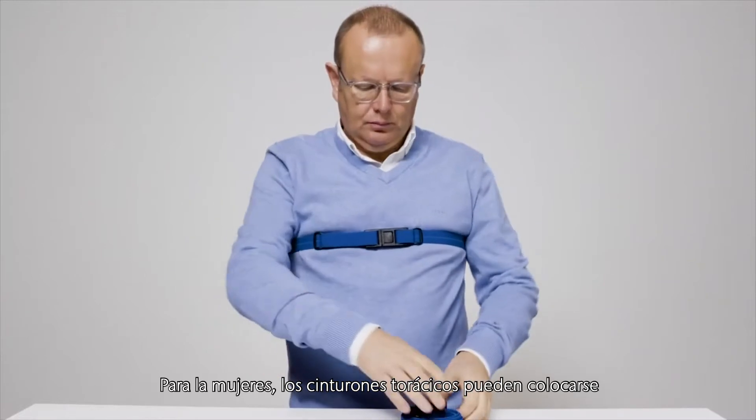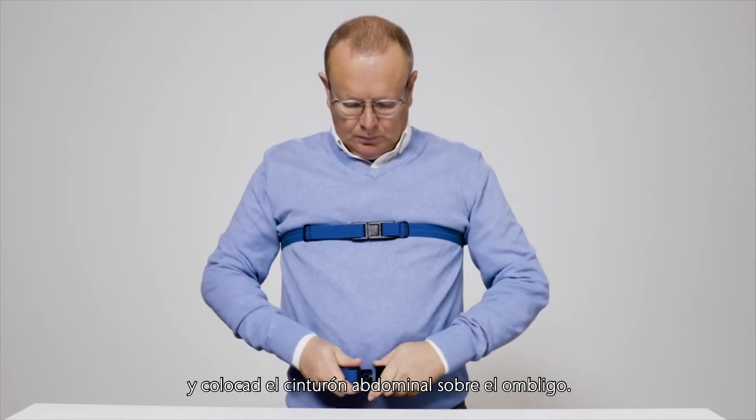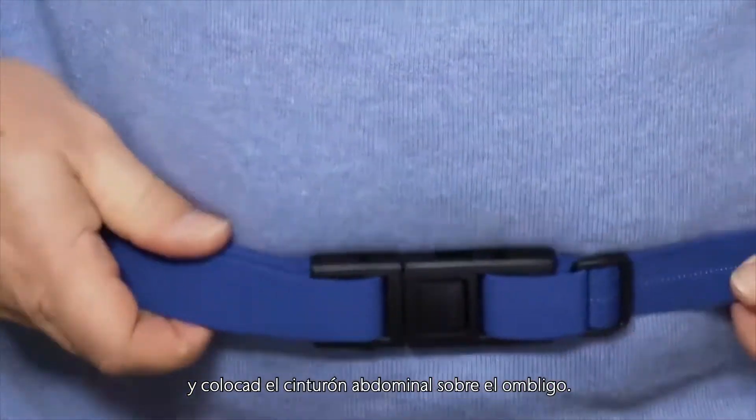For women, thoracic belts can be placed underneath the breast. And place the abdominal belt over the belly button.